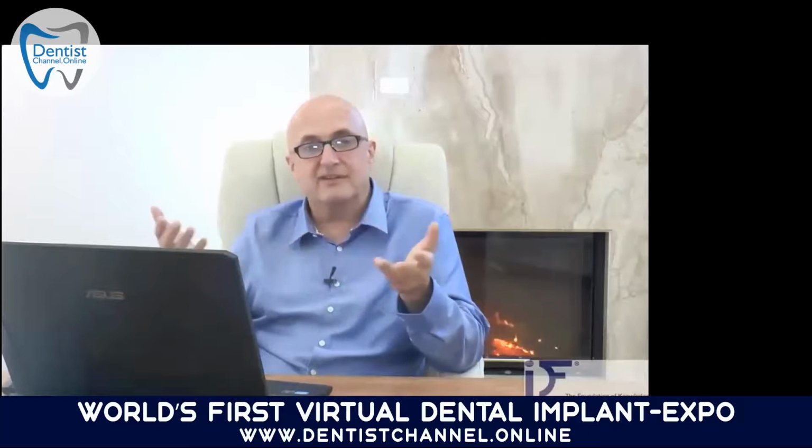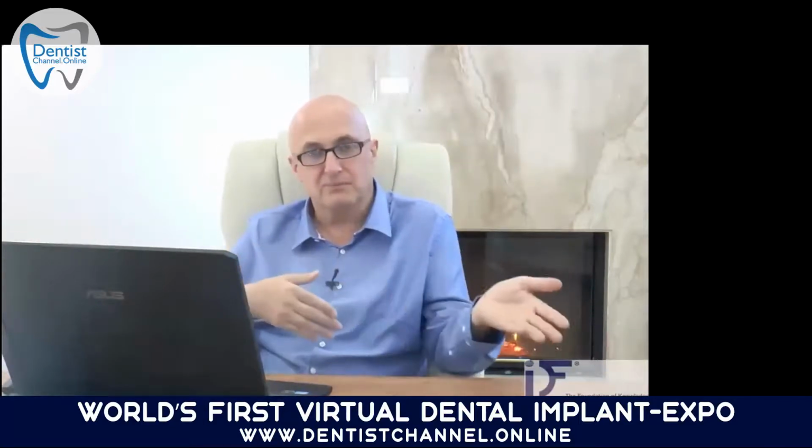But after this is the end of the necessary compliance. We cannot expect more from the patient. We cannot expect to change the habits, the addictions, the religion, whatever. The patient is the patient. We are being paid for doing things which help this patient. So obviously this two-stage implantology, this conventional implantology, is not something that helps the majority of the patients because they are simply normal people.